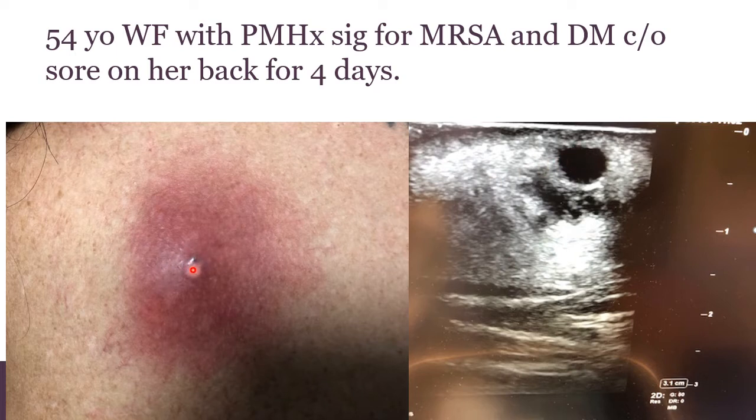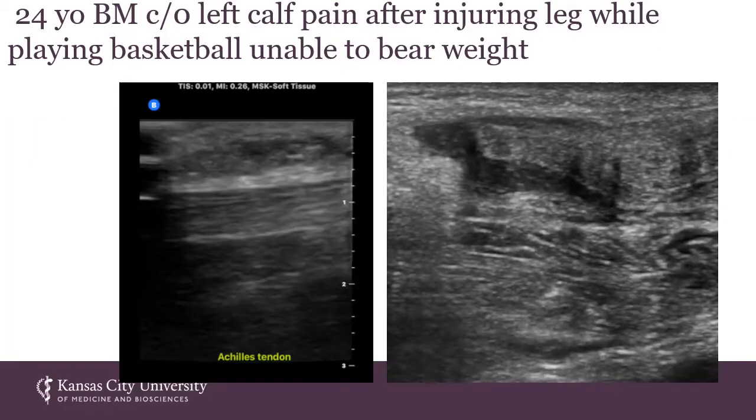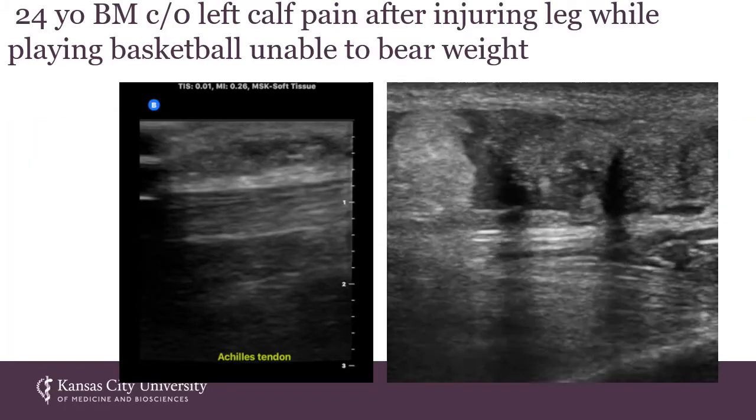But let's say I'm concerned, or it may be a deep abscess, I can take the ultrasound and I can guide the needle down into the abscess cavity, even aspirate it if I wish, and I can follow the needle with my 11 blade to get into the abscess and go straight in. So I can not only diagnose the abscess, but I can do an ultrasound guided I&D if I choose to. So this is a nice practical application. This patient I did see in the emergency room, but this could be an office patient just as easily.